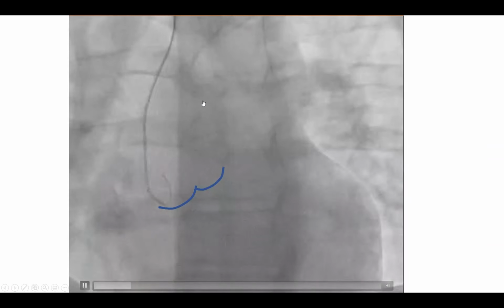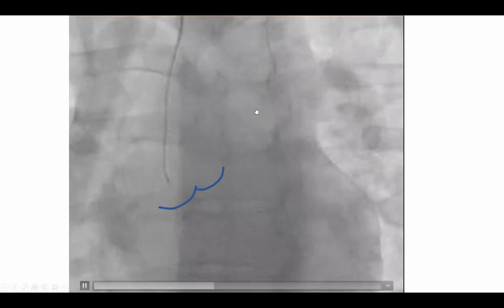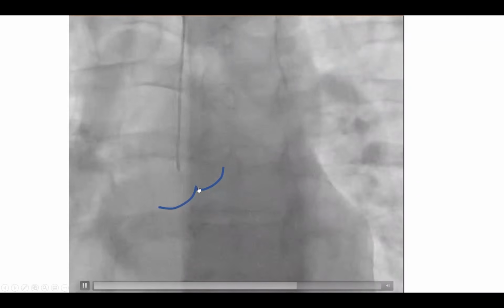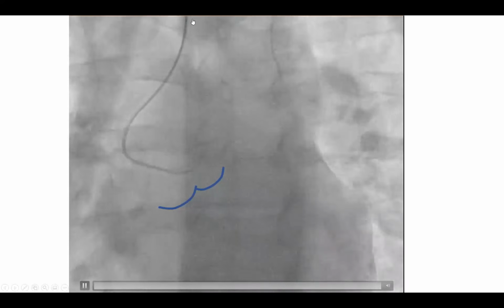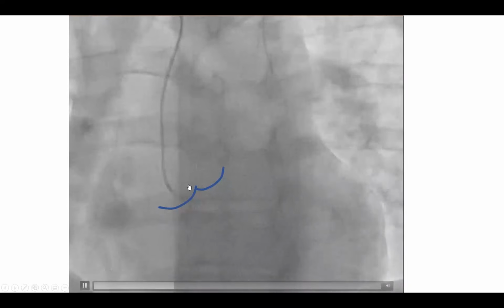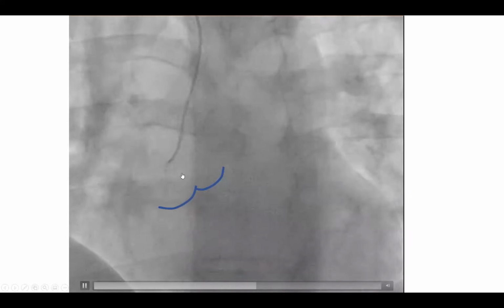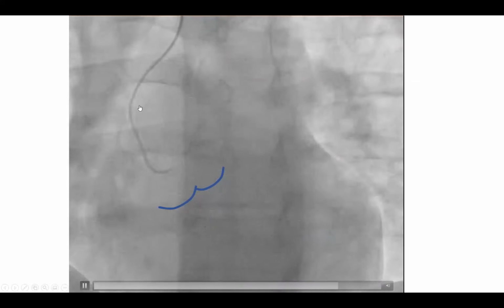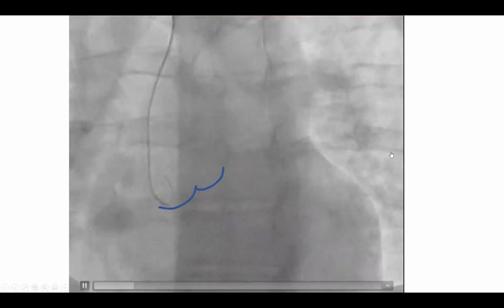This is another case of difficult coronary engagement, short aorta. Again, this is a catheter in the right cusp. In your brain, always imagine those, always put them in your brain. So in this case, from the right cusp, each time we try to jump, the catheter will want to fly out. So look at here, it's flying out. So we decided to just try to engage from the right cusp, to push that Judkins left 3.5, and we were successfully able to loop it from the right cusp.